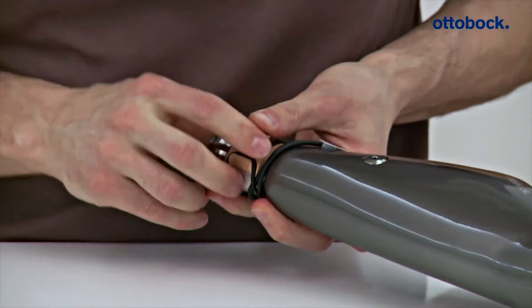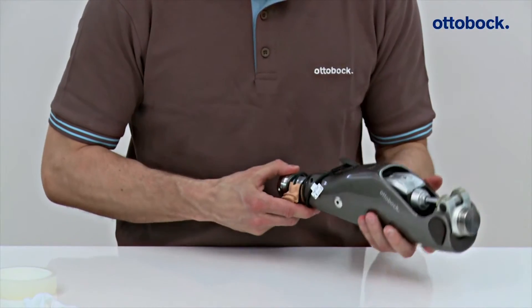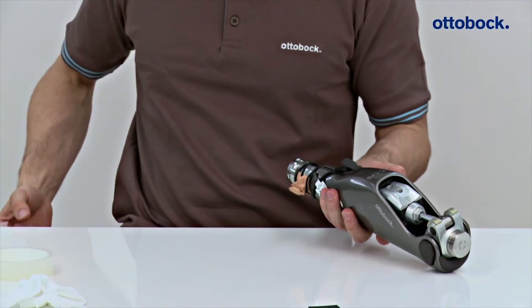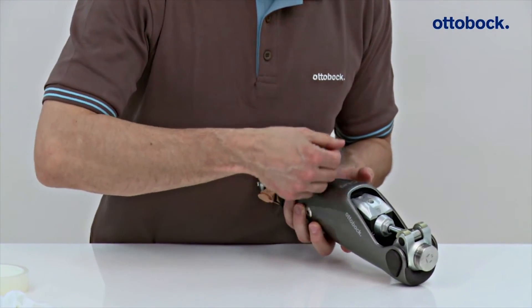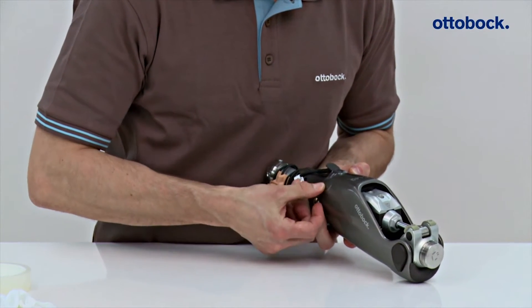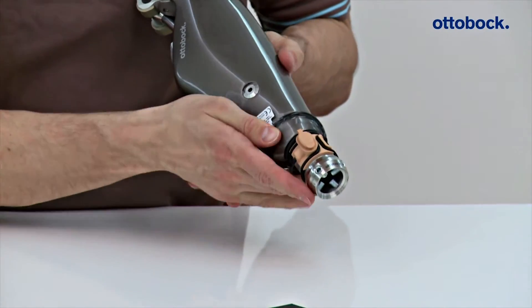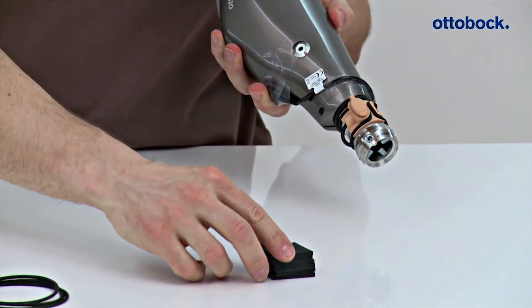Finally, the cable and the charging plug are secured with adhesive tape. If necessary, any space between the charging plug and foam cosmetic cover can be filled with the pad pieces included in the scope of delivery. The small O-ring can be used for up to 3 attached pad pieces and the large O-ring for 4 or more.